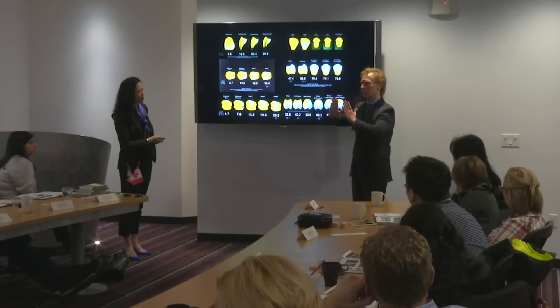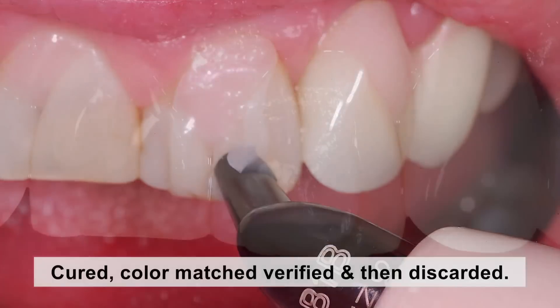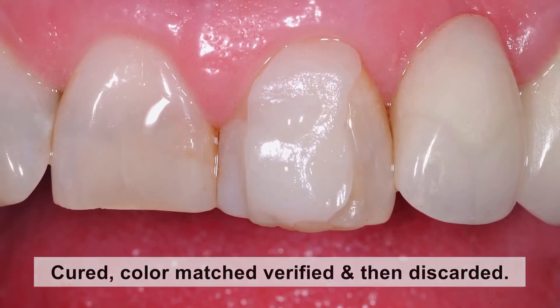The single shade of body composite is placed and cured under wet conditions to evaluate color choice. In this case, the patient chose B1 body shade.